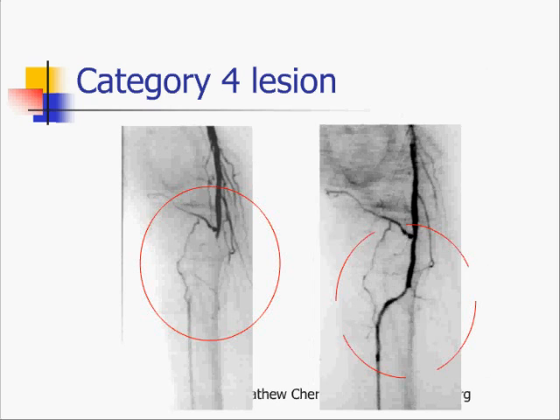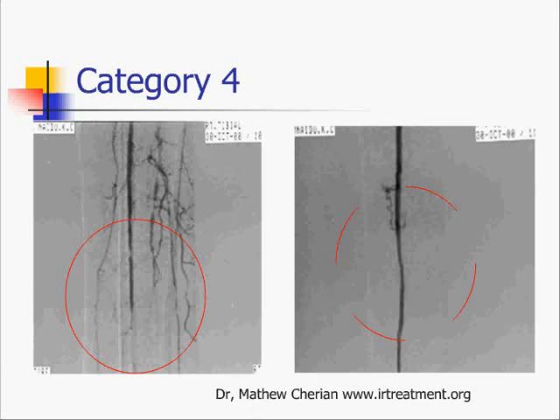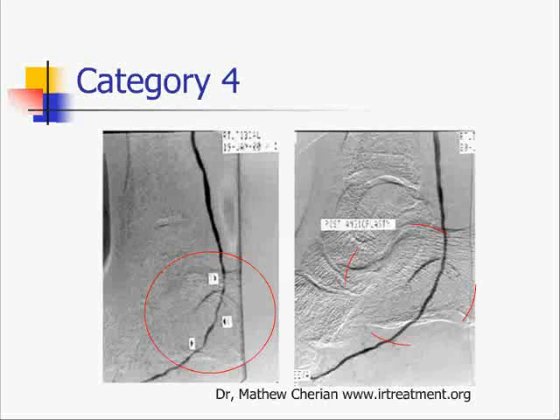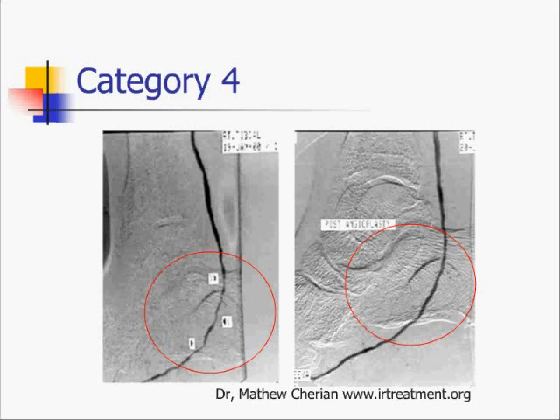Another category 4 lesion. Another category 4 lesion. And another category 4 where we have also had to treat the dorsal pedis. Another category 4 where the only vessel had a very critical stenosis of the posterior tibial at the level of the ankle.